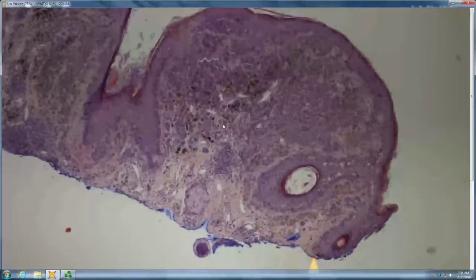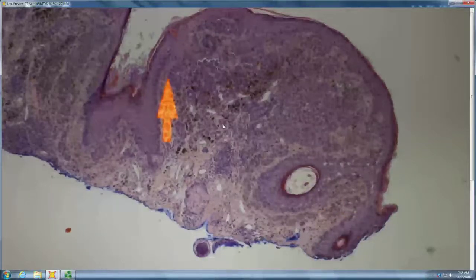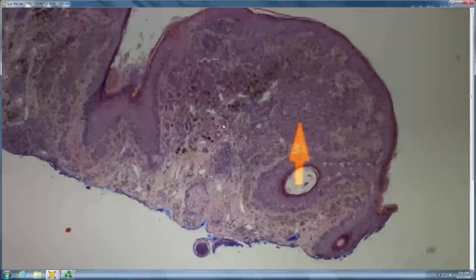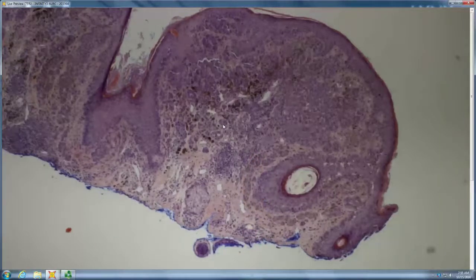There's confluence of melanocytes. It involves the arches. So if you remember, melanoma is your arch enemy, right? It is in the arches. And you have these long parallel trabecular-like walls, which is a parallel theque pattern of nests, which is all melanoma.